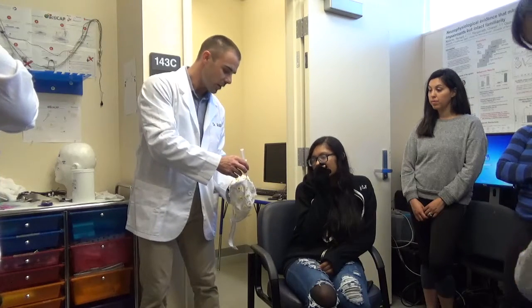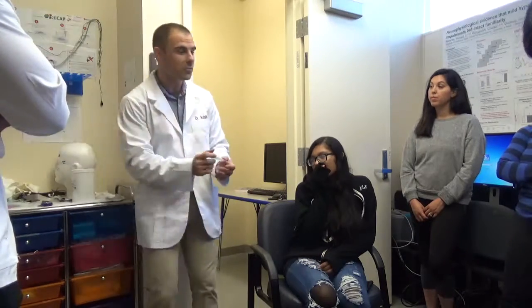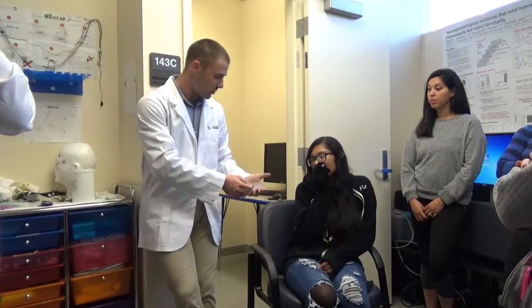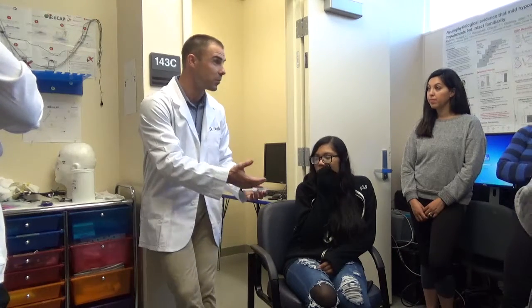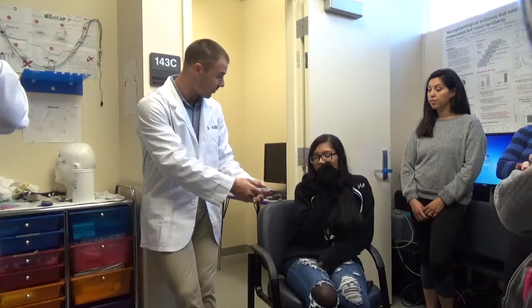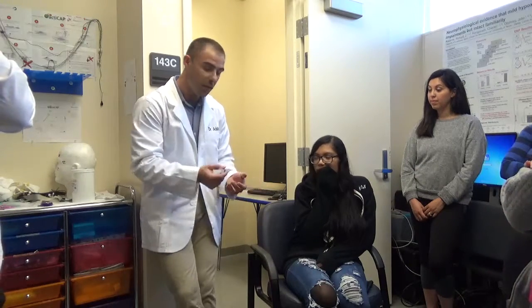Now, it's really important to put them at ease and let them know that this syringe is not sharp. It's a blunt tip. So you explain, this is a blunt tip, don't worry, it's not going to hurt you, we're not stabbing you. And you ask them if they want the opportunity, they can feel it and touch it. You want to touch it at the end, so you can feel that even if it actually touches you, it's not going to puncture you or anything like that. And then it's really important to take this next step, which is to actually show them what they can experience of what's going to happen on the scalp.